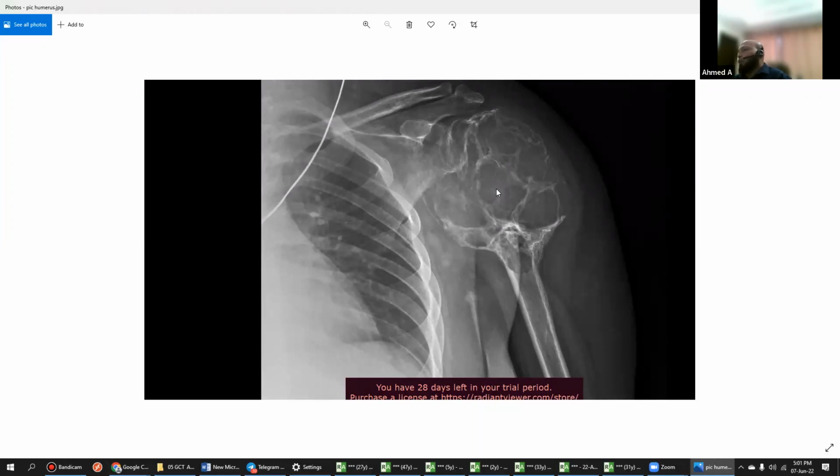Usually they say fallen fragment is not seen in every case, but again in exam they show you the fallen fragment sign to say it as an SBC, simple bone cyst. Okay, so this is GCT. You have to tell the differential, and telangiectatic osteosarcoma was also a good differential. So how will you differentiate that? Another important point: the fluid levels will help you? That is only histopathology. Okay, remember that.